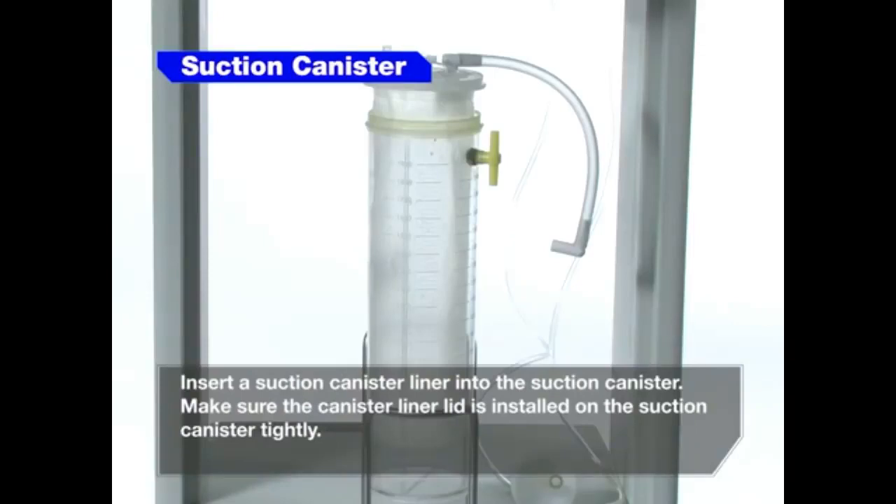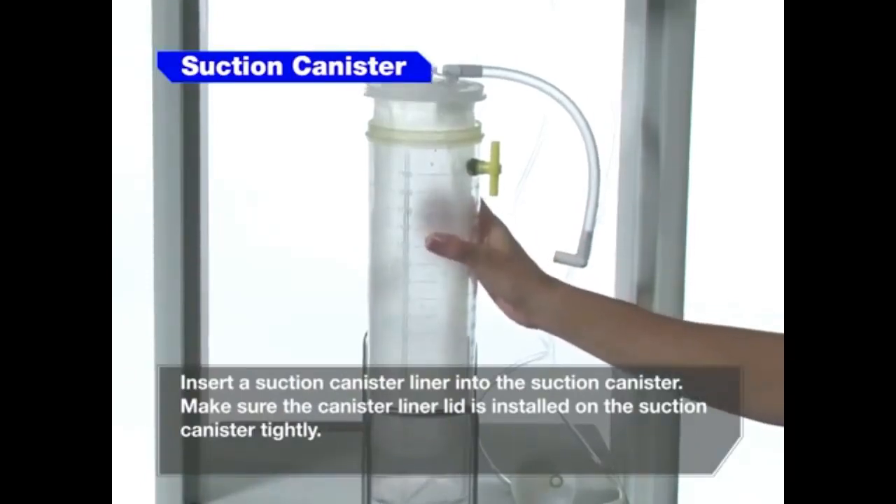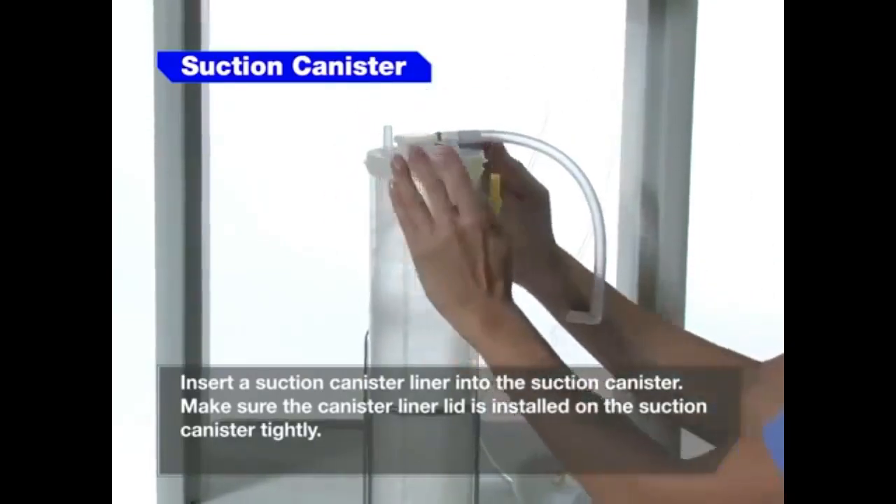Insert a suction canister liner into the suction canister. Make sure the canister liner lid is installed on the suction canister tightly.